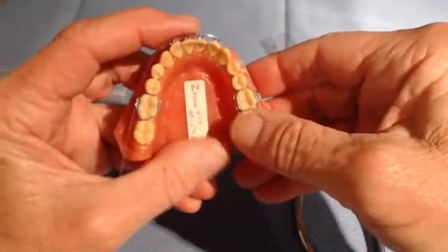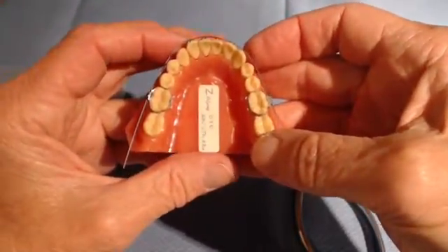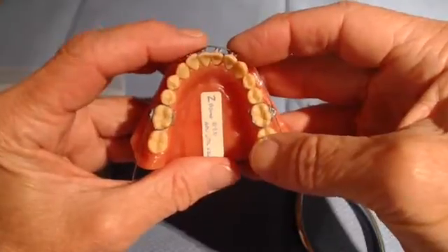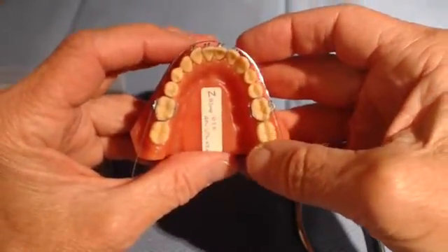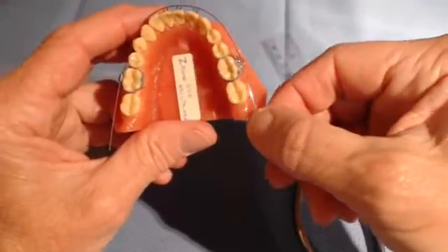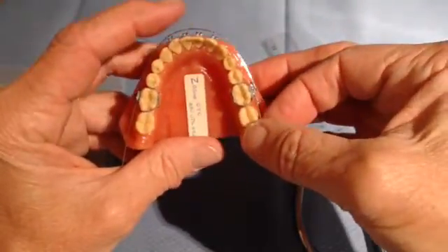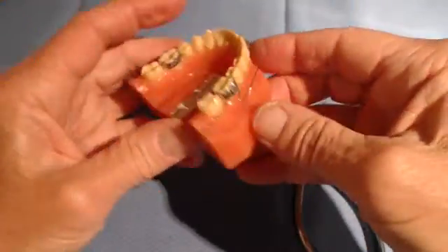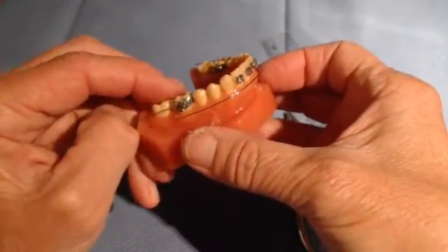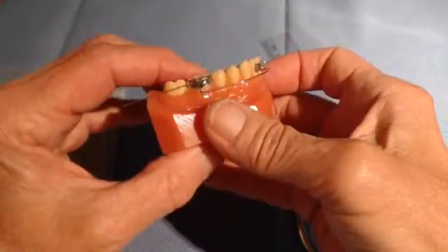Then you can take an impression, fabricate and cement a lower lingual arch, remove the lower incisor brackets, and that lower arch phase 1 aspect of treatment will be done. I hope this has helped you in your fabrication of a Z-bend utility arch. Remember, you need to practice this on a model before you ever do it on a patient, because trying to do it with these long wires in the distal would be impossible inside the oral cavity. Take an alginate impression over the bands and prepare this at your desk or lab at your leisure — when you take it to the patient's mouth, it should fit very nicely. Remember to cut the distal ends flush to the tube because there's no cinch back. Notice too that the wire has a slight intrusive force, but because of its flexibility, you'll never see any deleterious effects of this.